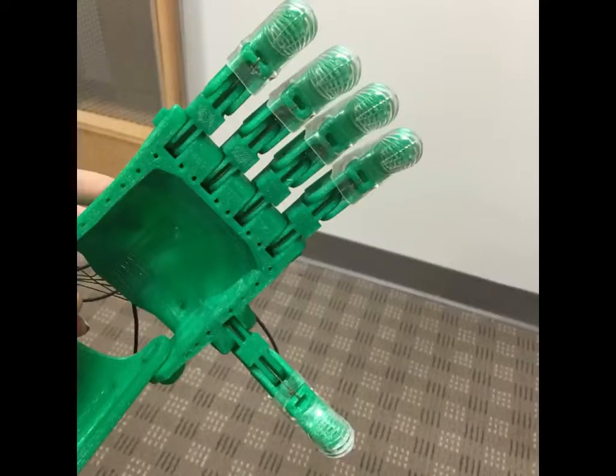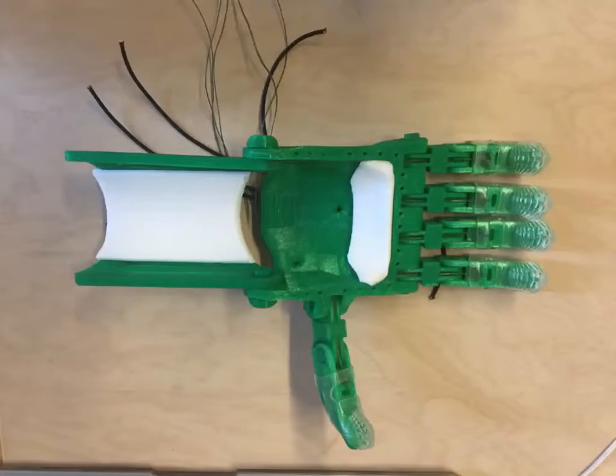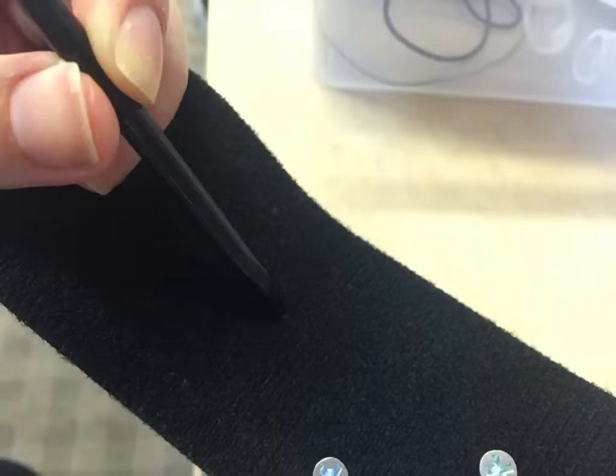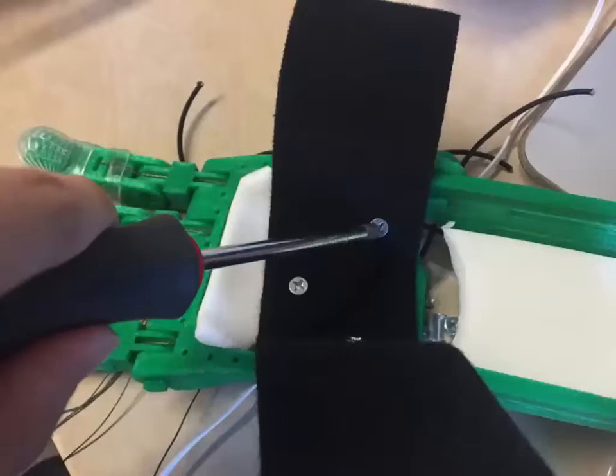With the cords secured, we moved on and inserted the gel fingertip grips. Then we cut up and inserted some firm foam padding and velcro so that we could protect the user from being scraped by the harder 3D printed parts. To attach the velcro, we had to poke a hole through it and secure it with screws.